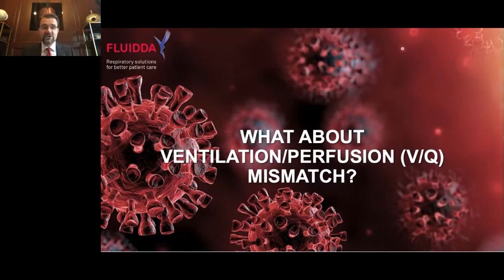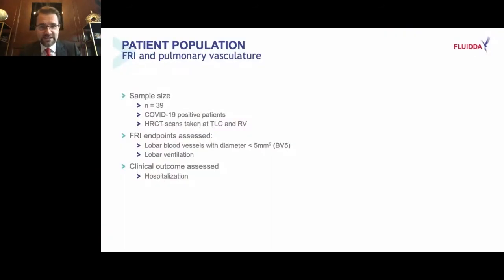What about ventilation perfusion mismatch? Another big debate that's ongoing, where hopefully this type of technology and data could also help to facilitate some of those questions. So we were able to acquire an interesting data set where we had inspiratory and expiratory scans in COVID-19 patients quite early on in their disease. So this was the first wave. The data came from Brazil, where they were using CT scans to diagnose the disease, because at that point PCR tests weren't widely available.